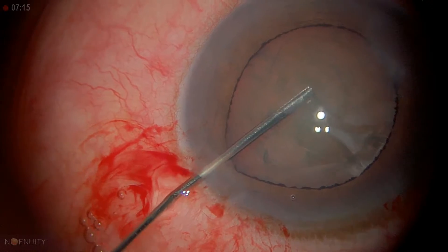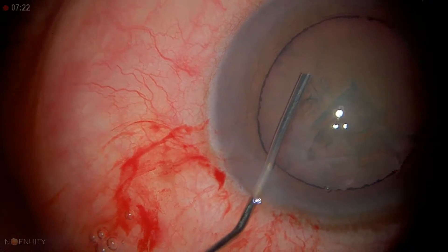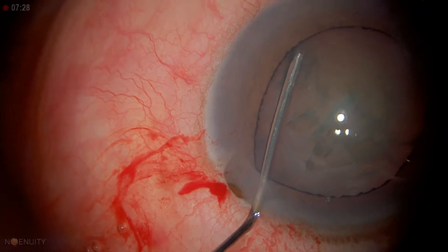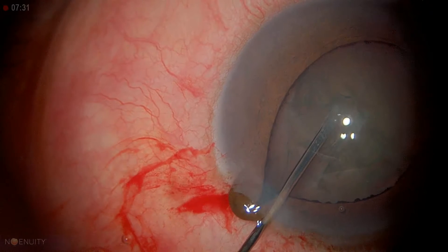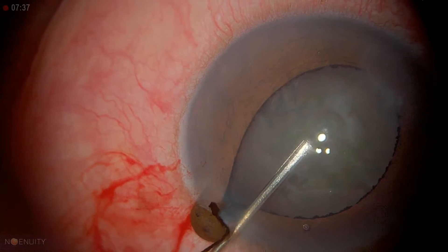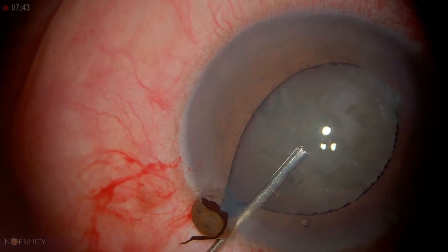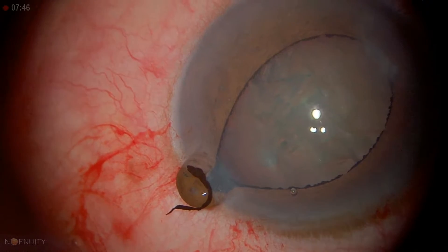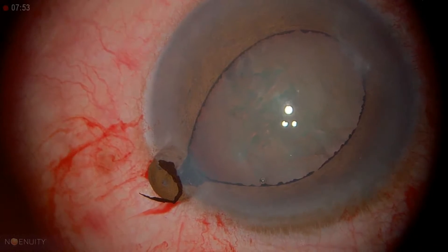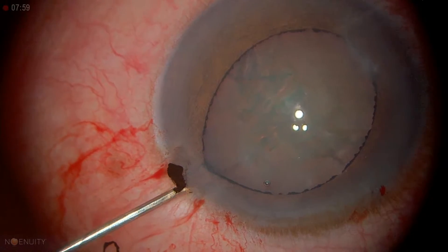I'm getting a little iris to the wound, so I'm going to press down and add just a little bit more. I'm getting some iris prolapse, which is not good, so I'm letting some fluid out. It's viscoelastic. I'm pressing down on the wound. Remember, we talked during the lecture to let some fluid out of the paracentesis. Now we should be soft enough to allow that to go back in.